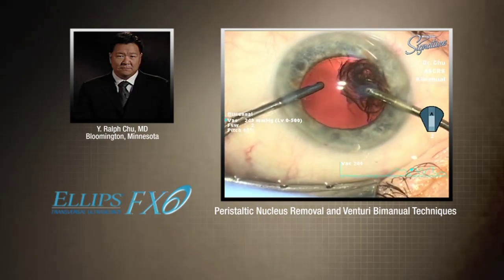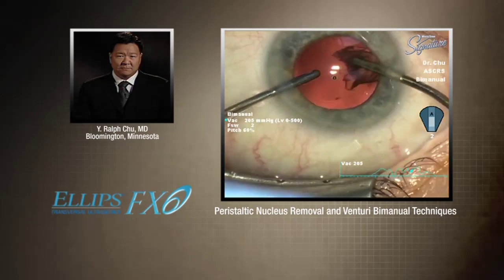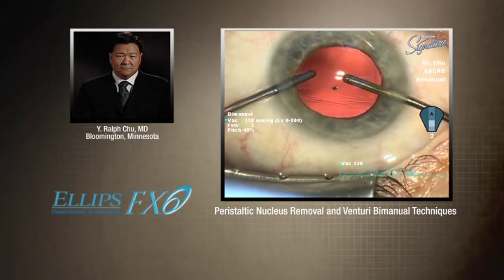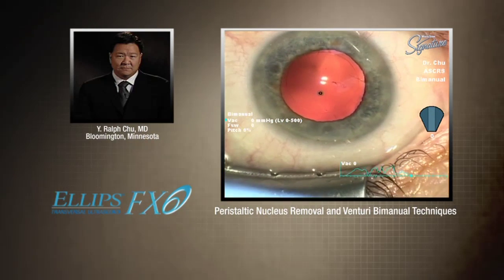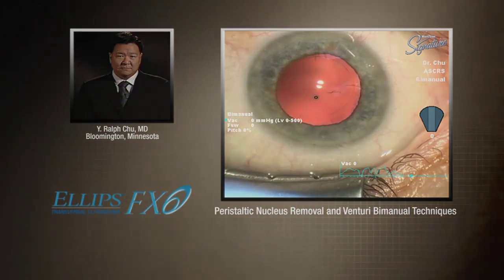I'm switched to a bimanual IA with a vacuum level of 500 — it's Venturi. I just think the most efficient way of removing cortex and viscoelastic in my hands is with a Venturi system. I think with accommodating IOLs, especially potentially some newer generation ones, having a very clean anterior capsular rim as well as a posterior bag is critical to having successful outcomes. So I love Venturi IA.